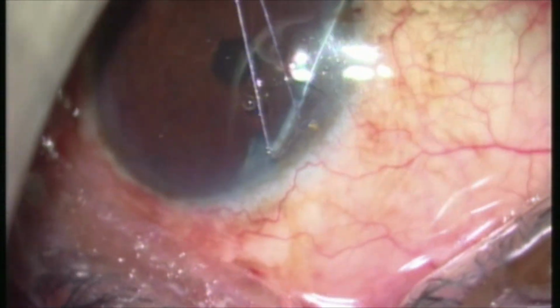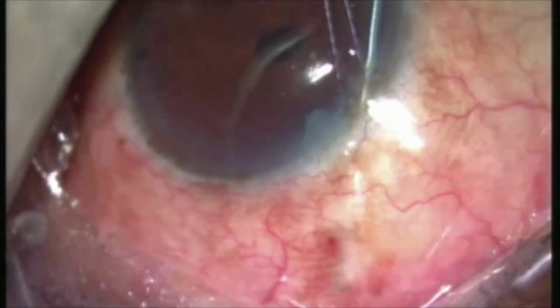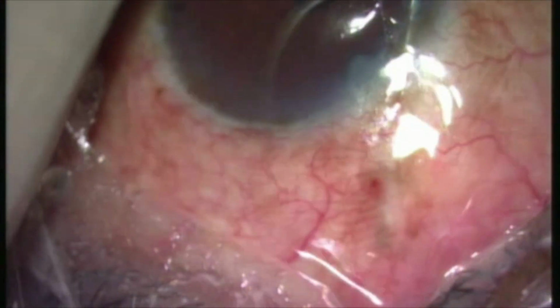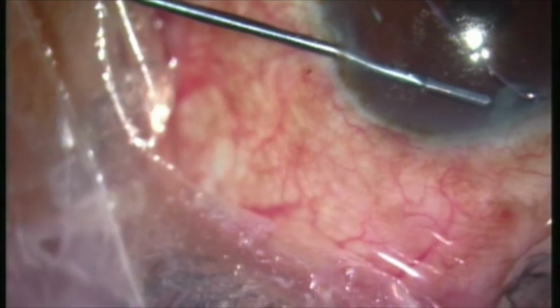The spatula is then introduced through the paracentesis site, which gently slides through the ostium below the scleral flap, ultimately making its way to the subconjunctival space. A similar procedure is repeated from the other side.